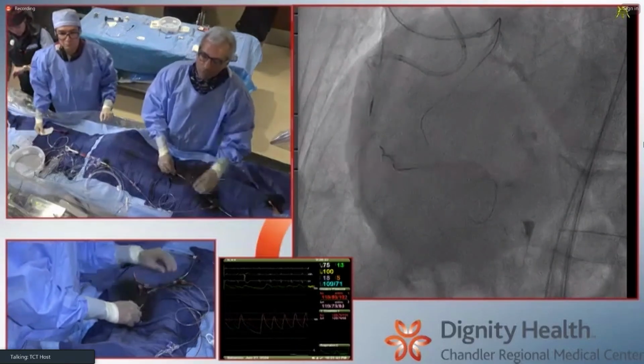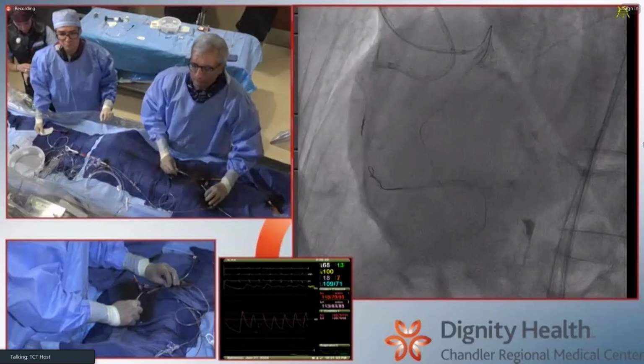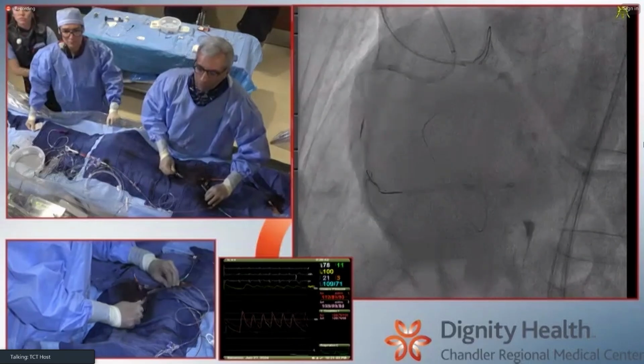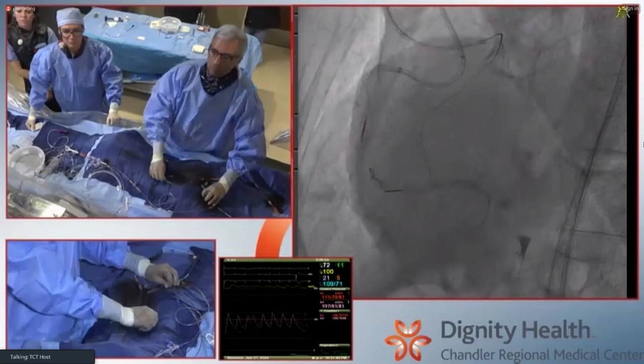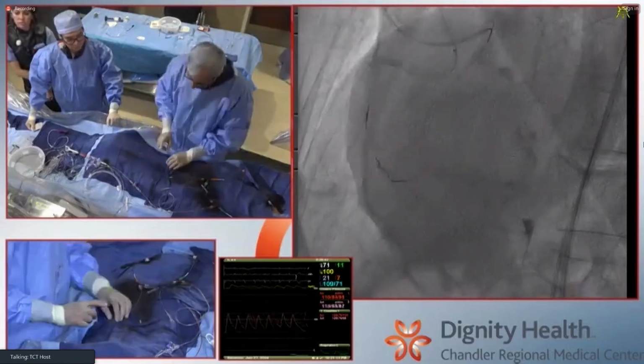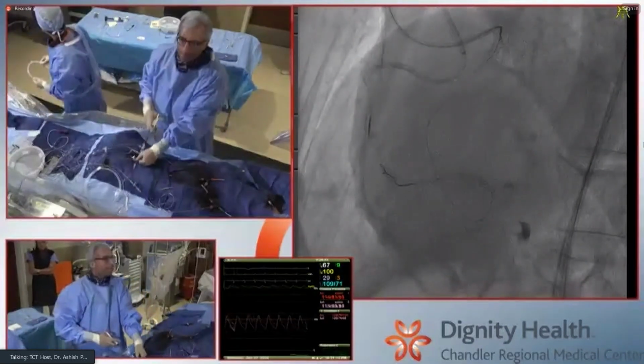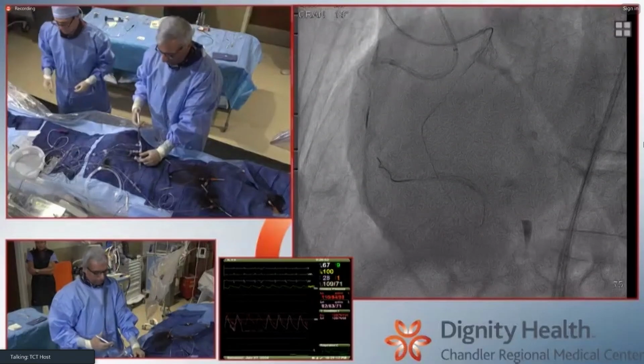I think in this vessel, it's a huge vessel. So honestly speaking, you're going to need a big balloon to complete a reverse CART. It doesn't matter if you use a Pilot 200 or a Raider or a Gladius. Give me a Pilot preferred antegrade. A retrograde knuckle wire is almost always a Gladius. That is just safe. Retrograde knuckles are safe by design.